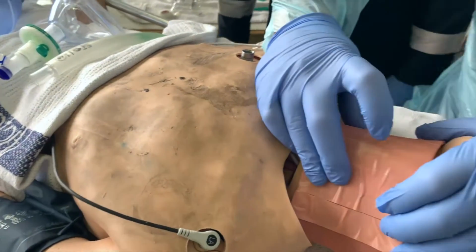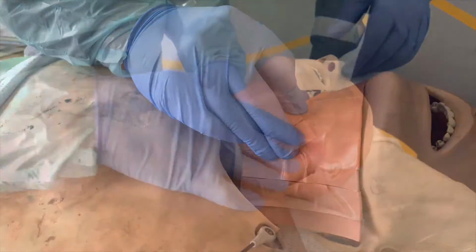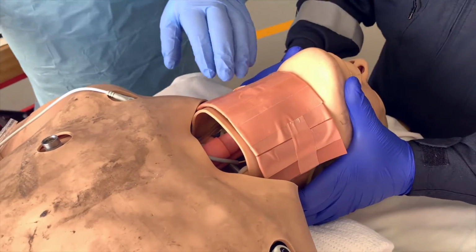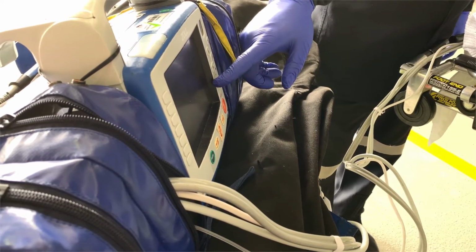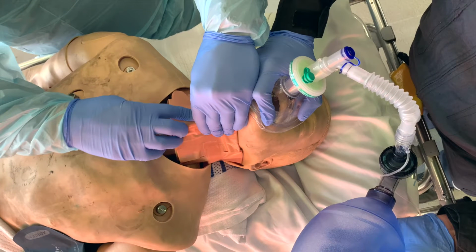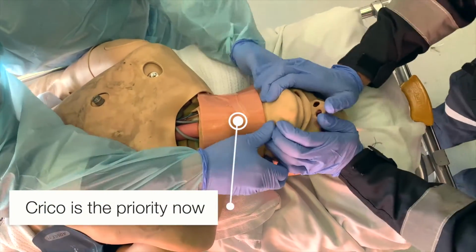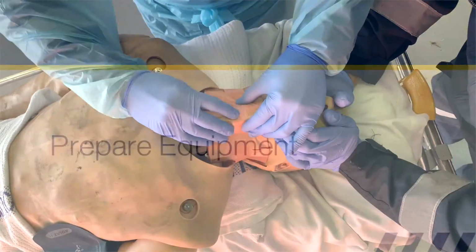Ideally, this procedure should be performed using the dominant hand, so position yourself accordingly. Additional team members provide support, including holding the head in the hyperextended position, verbalizing vital signs, including heart rate, oxygenation, and capnography, and, where primary cricothyrotomy is being undertaken, continued attempts at oxygenation may proceed. However, in the setting of the difficult airway guideline where CICO has developed, further attempts at BVM can proceed, but should not delay nor complicate the establishment of cricothyrotomy.